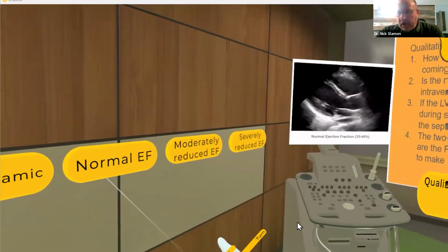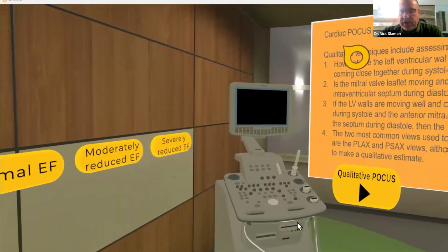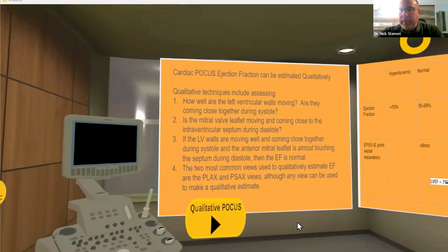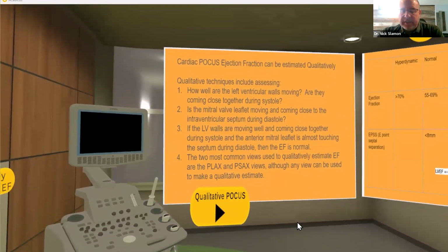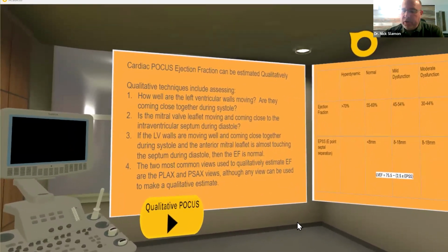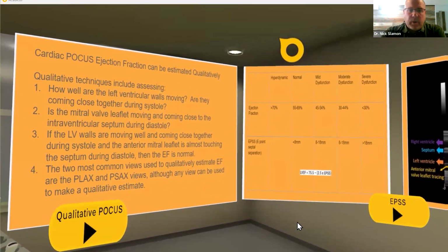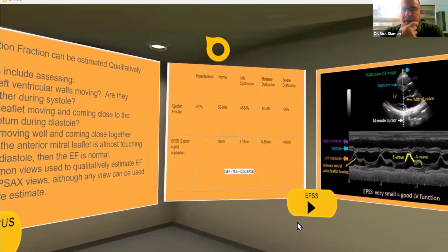We can create our own quizzes within Acadicus where you can check your learning about how you understand the topic. We did that in a separate module with a very simple pairing exercise where you would place the action button on the right anatomic part of the chest and pair that up with the echocardiogram view that would go with it.